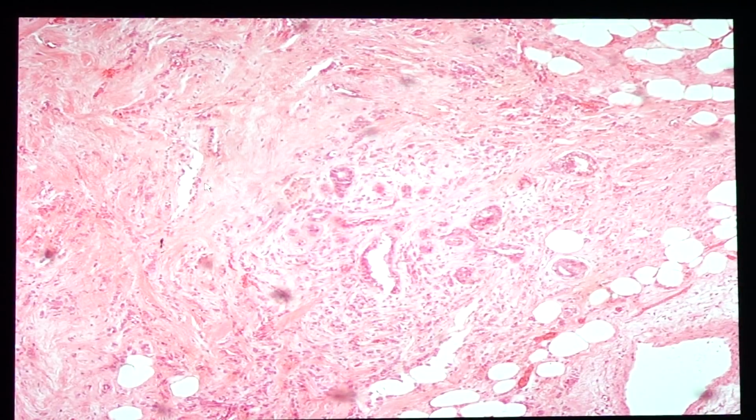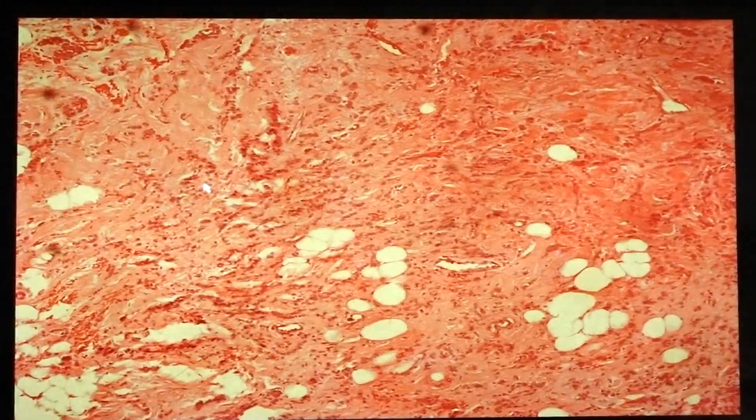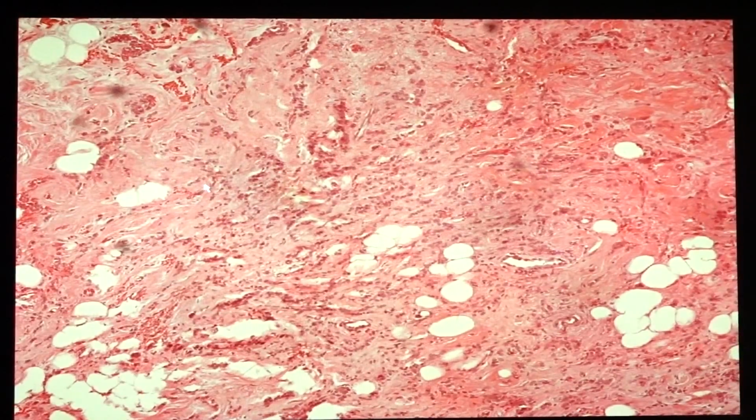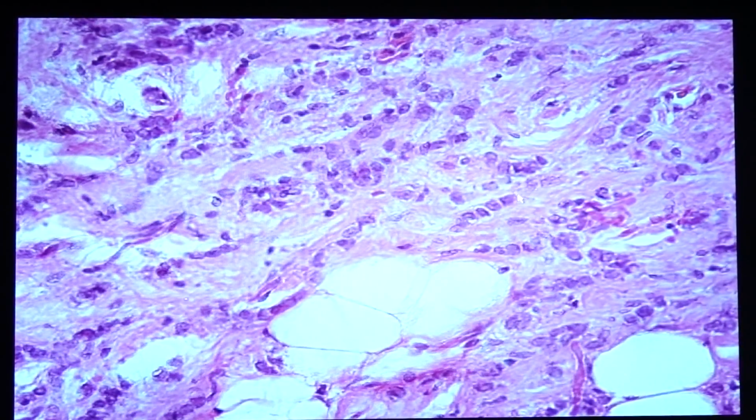So it's not in the book, but that is the one that we use to characterize or identify or classify that it is an invasive lobular carcinoma. In the book it says the presence of a signet ring appearance. So that is another form of identifying the atypical lobular cells. But in the slide we do not have the signet ring appearance. What we would see would be the Indian file formation. Okay, this one.